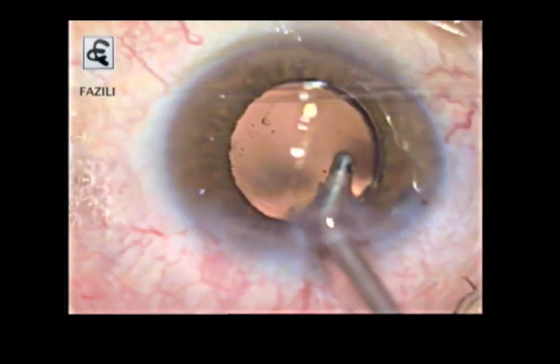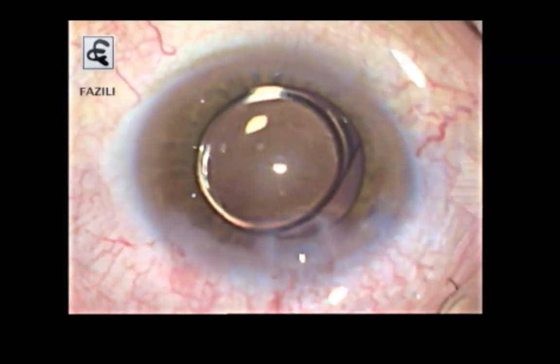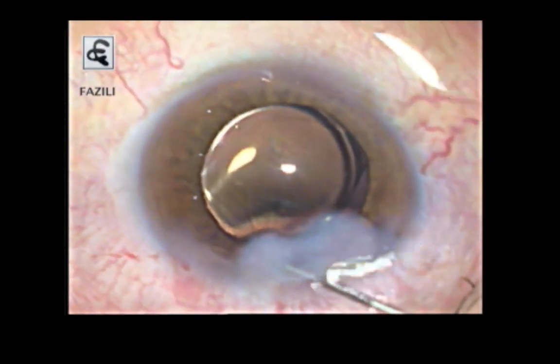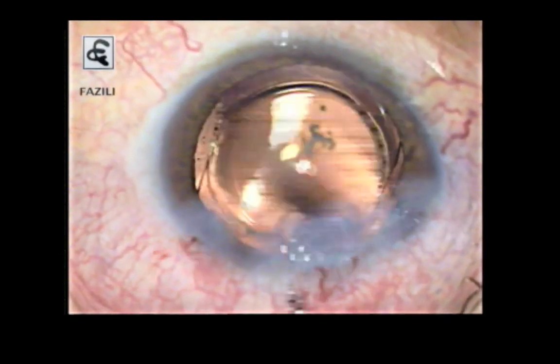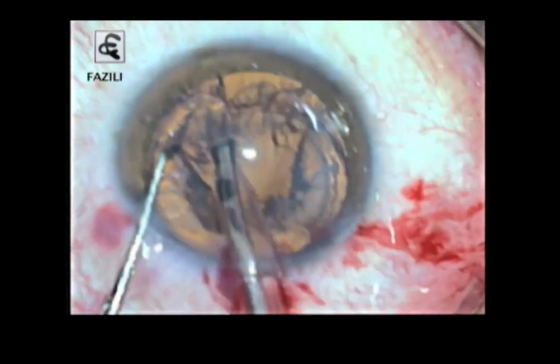Here you can see what I've done is some stromal hydration, then leave it in the incision so that it causes some amount of stromal hydration, and that has helped me in reducing the fluctuation in the anterior chamber depth at the different times at which it might have occurred, making the surgery a little bit more safe. So these are all maneuvers to avoid the collapse of the anterior chamber.